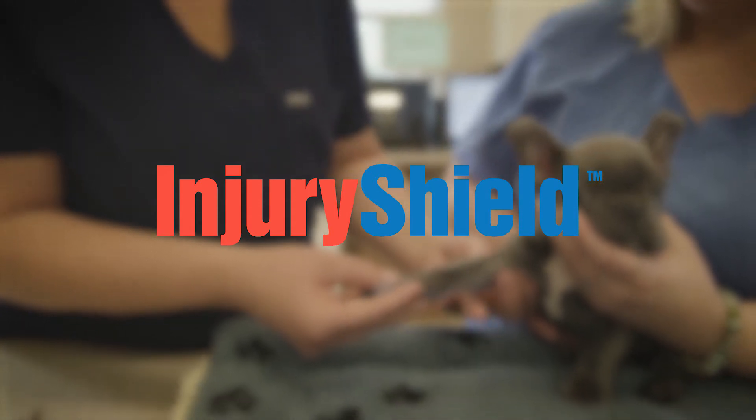Injury Shield needs to be in every veterinary hospital because you can go from a kitten leg for stabilization to a Great Dane for wound protection to a tortoise for possible shell repair. You can really take the material and use it in all these different aspects.